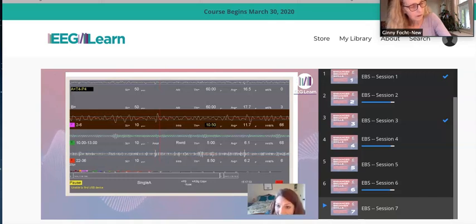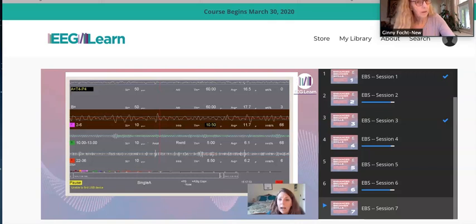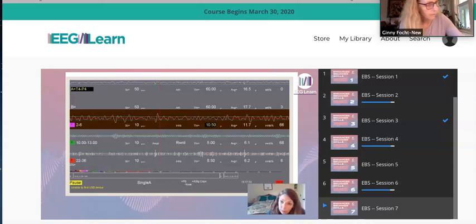Okay, so here again, we do not want one of our inhibit bands being noticeably higher than the other two in amplitude. If it is, that's going to be the target of our training. So in this example, the 11.7 is noticeably higher than the other two. So that's going to be the target of my training. That's where I'm going to set my threshold the toughest. I'll make the other two easier. I'm going to put all the emphasis on helping this person shift their focus out.